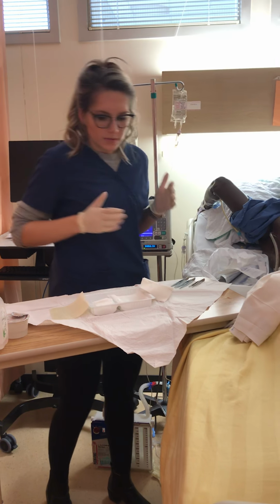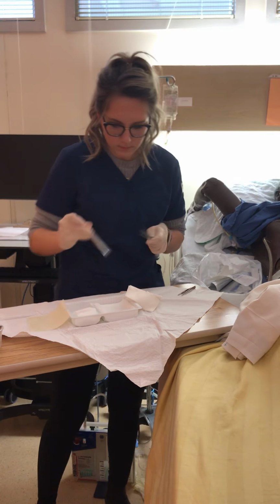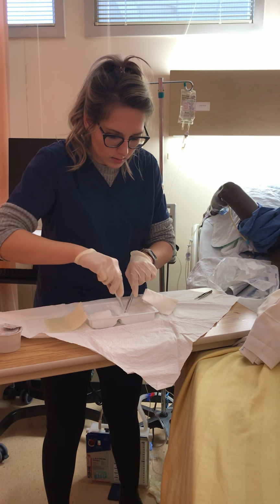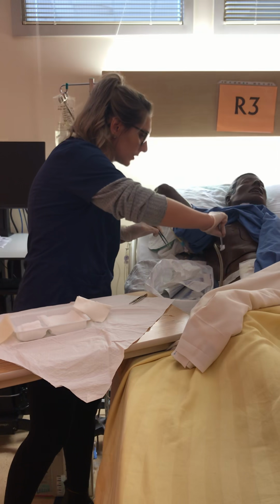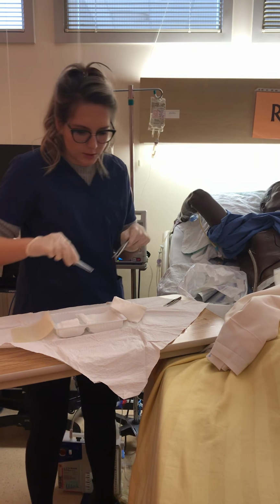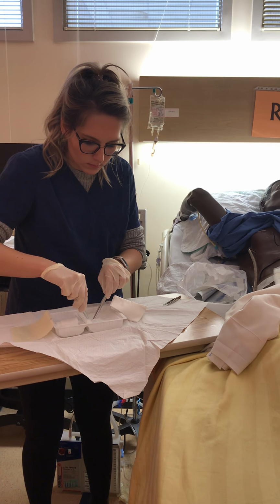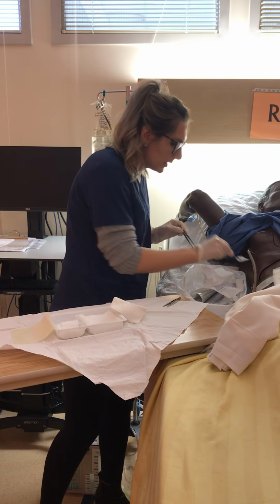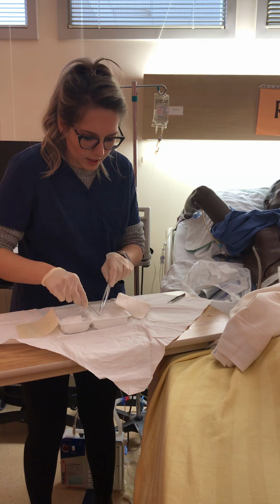Okay, so now I'm going to begin cleansing my patient's site. I'm just going to make my little rosette here. I'll do one more around, kind of further out. So I'm just going to do a half circle, keeping my forceps down, dropping my garbage 6 inches above. And I'm going to do one more wet gauze down the length of the tube. Okay, and then we'll just do underneath, dropping above, not touching any of my garbage.